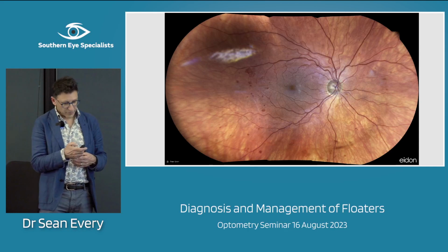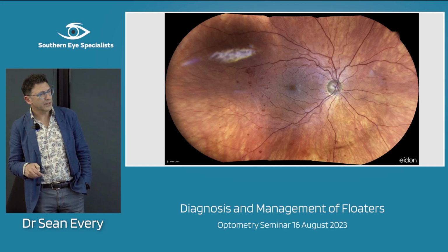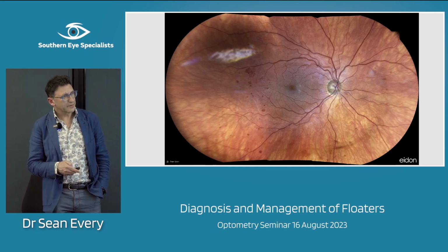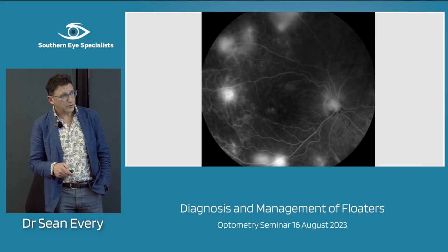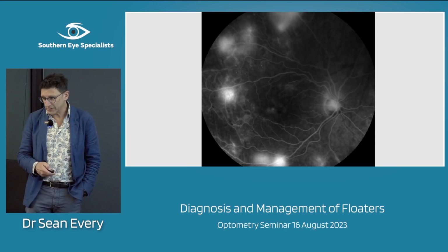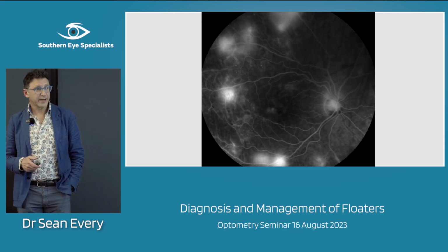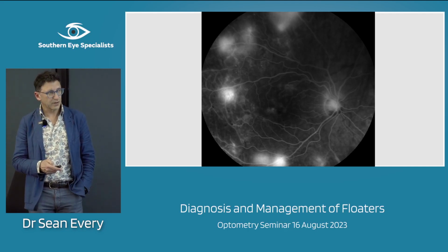And then this is proliferative diabetic retinopathy, and I think there's a frond of new blood vessels sitting out here. You can sort of see a trace of a bit of hemorrhage going on here. But the interesting thing about this one is that this is the same person, and this is her fluorescein angiogram. So this is the one that we saw easily. But look at that, bang, bang, bang, bang, bang. All these places are growing neovascularization that's hard to see. And probably a tuft at the disc as well. So often it's useful, not so much for that eye, but for the other eye to go, do we need a PRP or not, and you really unmask the true extent of the disease.